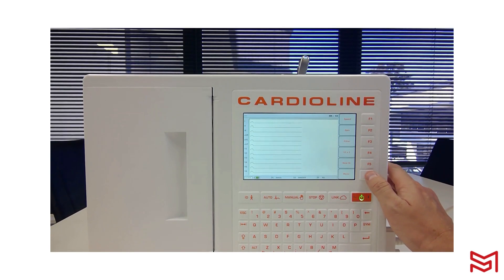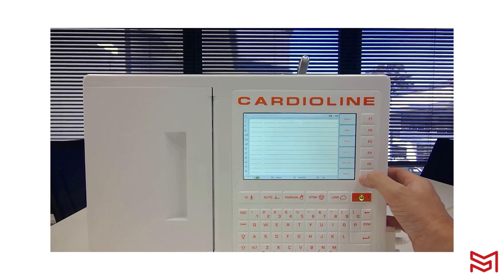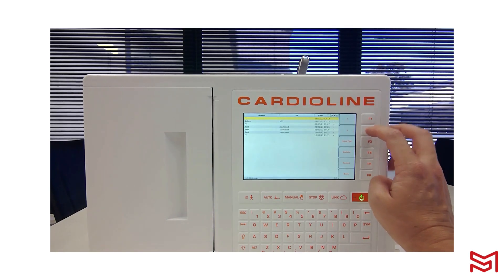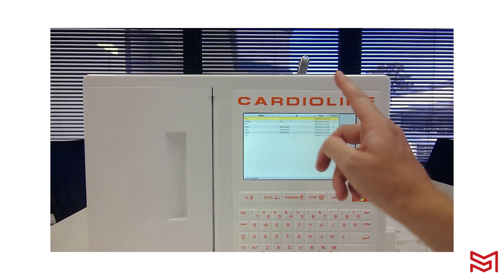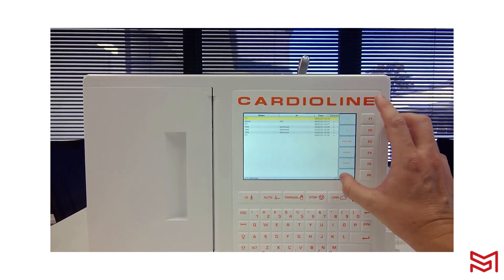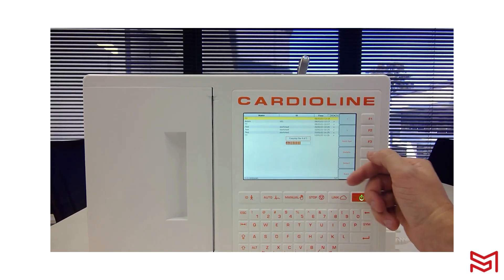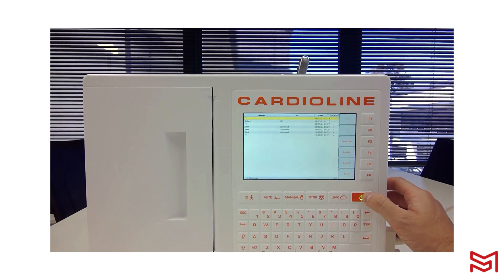The other way to export is via multiple recordings. Click F6 for your menu — this is where you find the ECG archive — then click F2 for the ECG archive. At the moment I have seven exams internally embedded into my device storage. Click Link and it will copy all of those files straight to your USB stick.